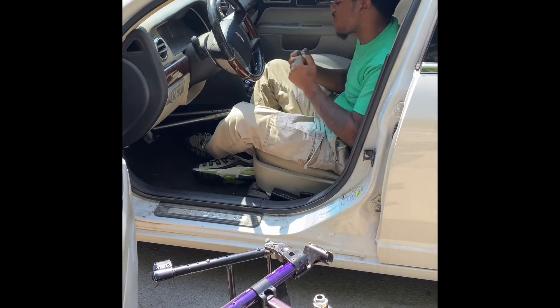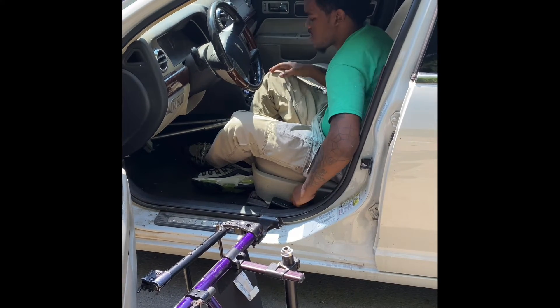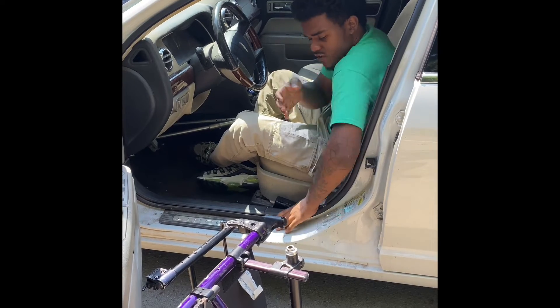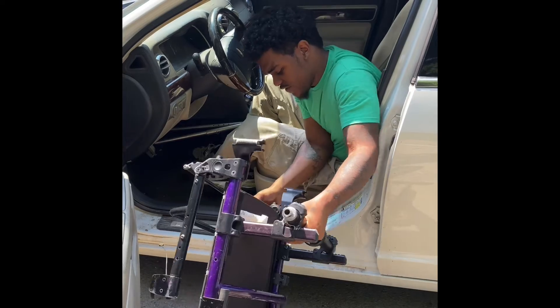I have really long legs and sometimes my legs can get caught up. While I'm driving, my knees will hit the driver's wheel. And if I'm trying to turn, the car won't want to turn because my knee is stopping the wheel.